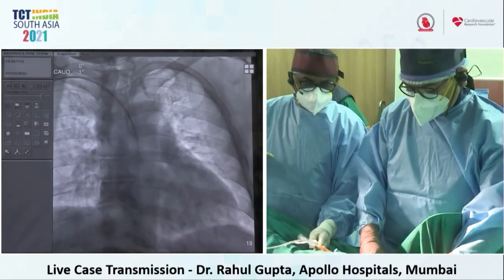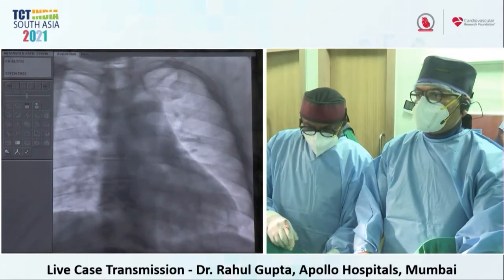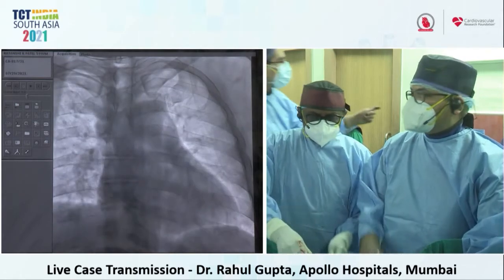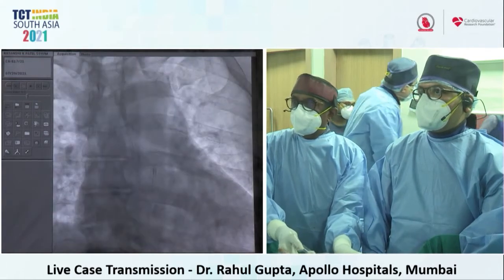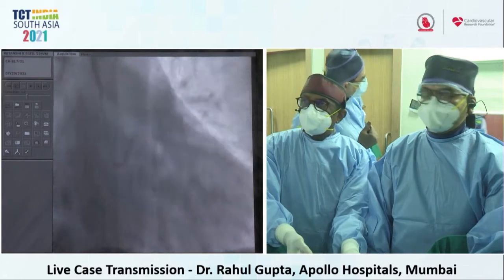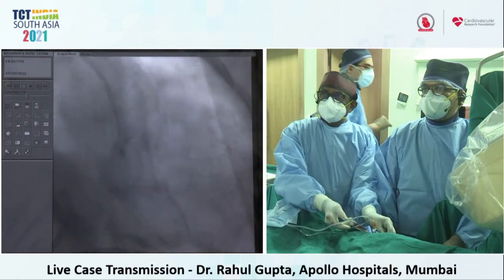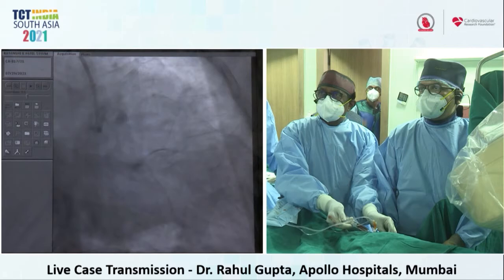Yeah, because when you're using the radial artery, after the needle puncture, it is much easier with the routine smaller wire, with the thinner wire that we use. So from that point of view, it is better to use the wire that we have been used to. In some situations where you think it's difficult to push it, you can choose a 0.021 wire. But most of the times, to enter the radial artery, it's much easier to use the wire that we are used to in so many cases.